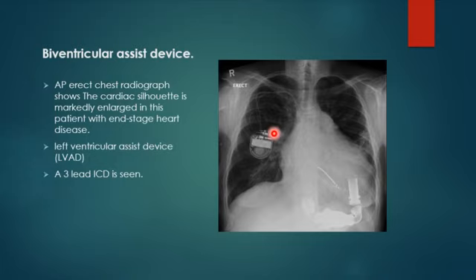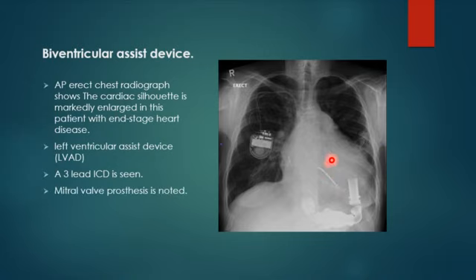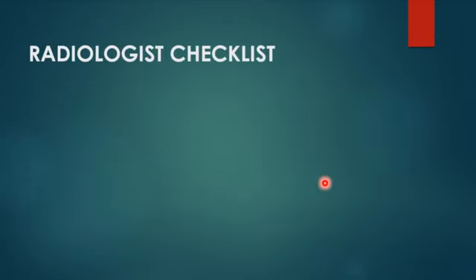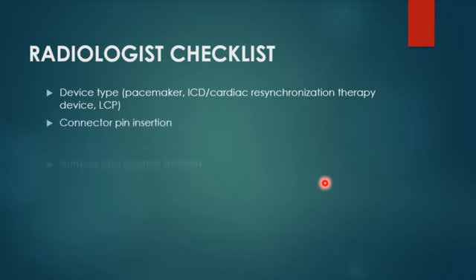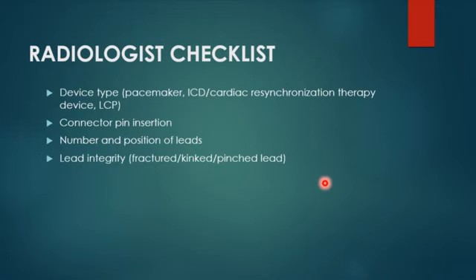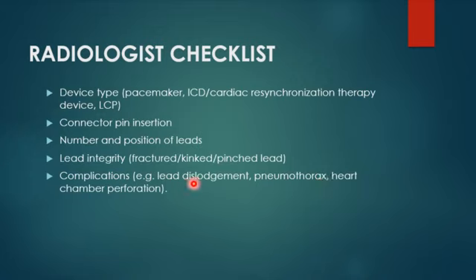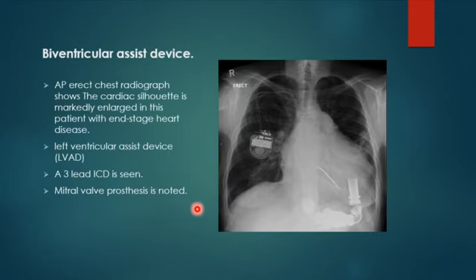This patient also has a cardiac device with three leads, and from the thick radiopaque shock coil you can identify it as a defibrillator. This patient also has a prosthetic valve. When you see a patient from the ICU with cardiac devices, make sure you know the type, the tip position of each lead, the number and position of each lead, and the lead integrity — ensuring there is no fracture, discontinuity, kinking, or pinching. Also look for complications such as dislodgement, pneumothorax, or cardiac chamber perforation — if leads are overlying the lung tissue rather than inside the heart, suspect perforation.